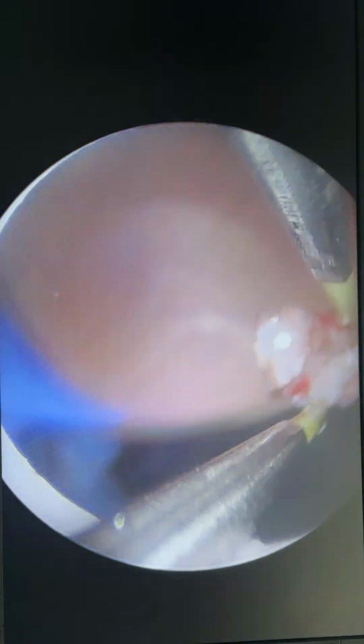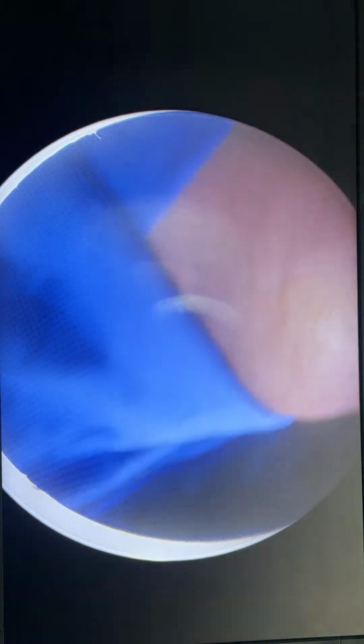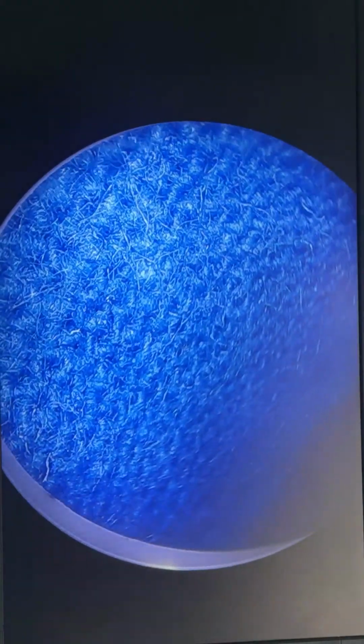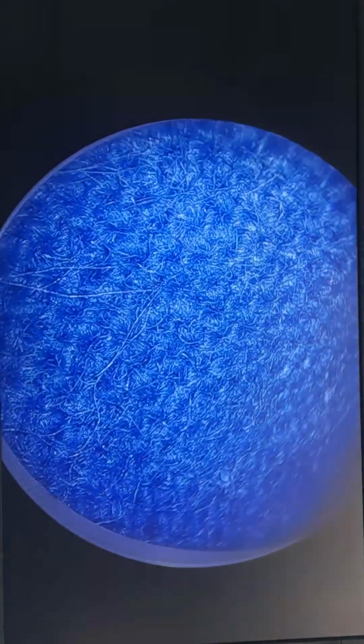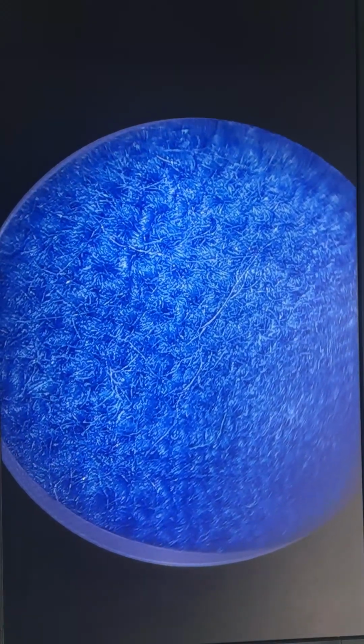So as we saw in the last picture, most of the chorionic tissue, the ectopic content, has been removed. The scar niche has been tackled with the resectoscope, and this patient will be followed up by ultrasound after a week and then serum beta HCG level. Currently our serum beta HCG level is 14,000. So we will keep on estimating them accordingly, and if they show a slow fall, injection methotrexate can still be continued. Thank you.